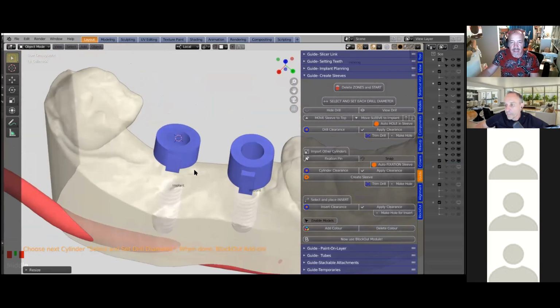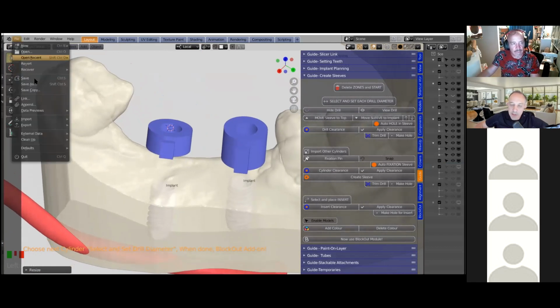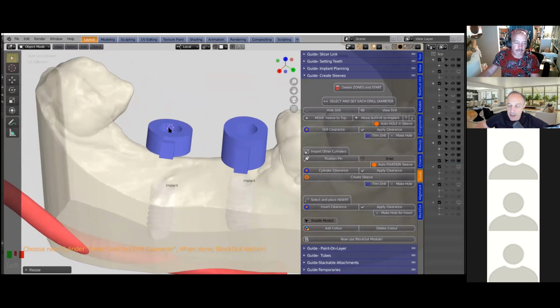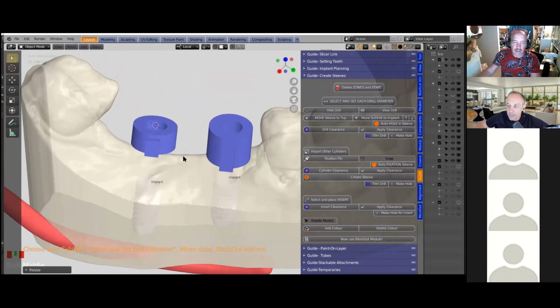Okay, so are there any questions related to this so far? I'm just thinking about the undercutting areas. Can you explain how to tackle that? Yes, Wolfgang, that's a good question.